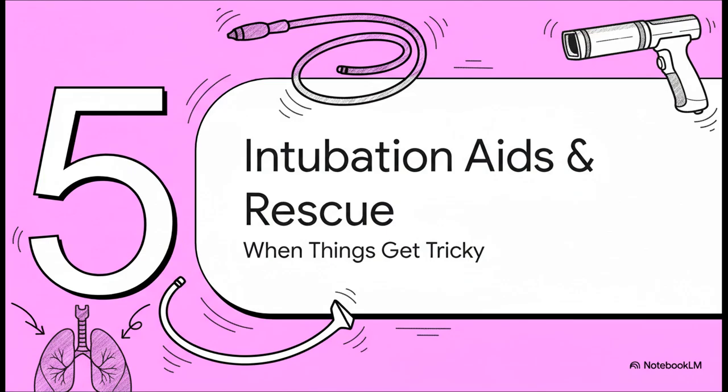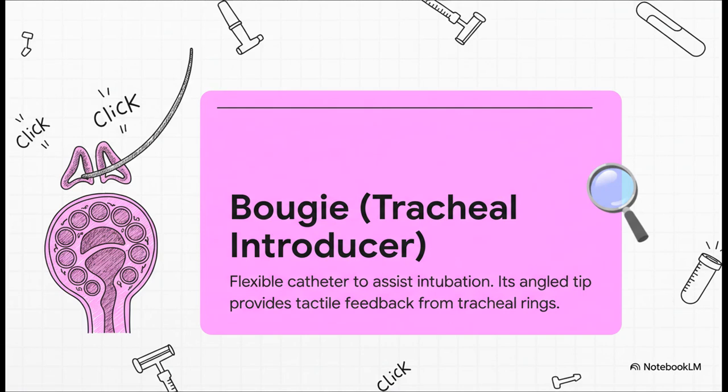All right, last section. Let's talk about the tools that help you out when things get a little tricky. These are the aids that help you guide that tracheal tube right where it needs to go, especially when the view isn't perfect. The Bougie. Seriously, this thing can be your best friend when you have a bad view of the larynx. The magic here is all in the feel. As you pass that angled tip through the cords, you can often feel a series of clicks, like a washboard, as it bounces over the tracheal rings. That feeling is your confirmation. It tells you you're in the right spot, even if you can't see it clearly.